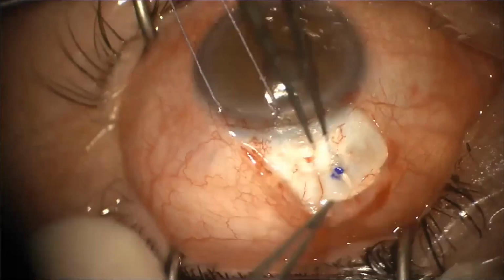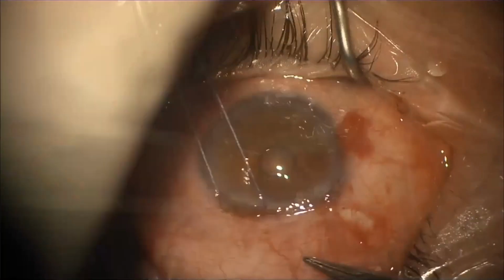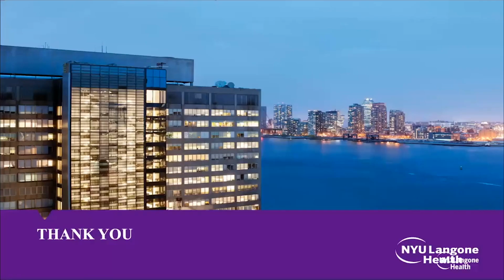Perfect. Bring the conjunctiva and Tenon's up, making sure that you don't catch the device with the Tenon's. Some people will actually close in 2 layers. That's it. That's how simple this procedure can be, and that's why many of us are excited for this new device. I hope that is a helpful lecture there. I have 10 minutes here just to give you a run through on the technique. Once again, I'll take any questions later, but thanks everybody for the invitation to speak today.